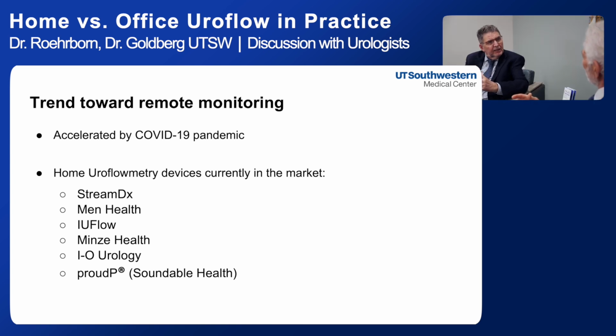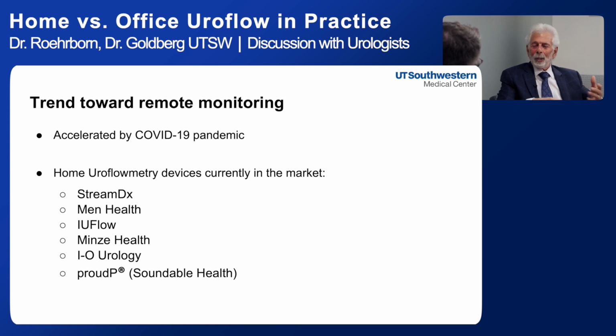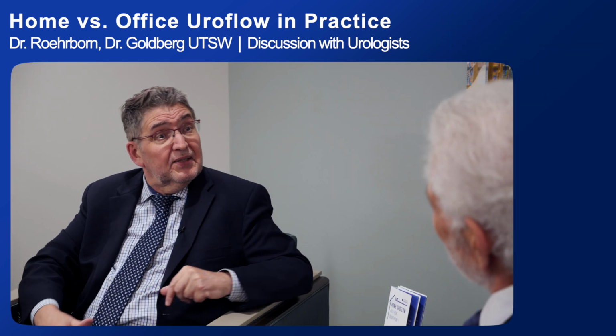So that's taking what we know as a spinning disc kind of container, and a cheap version of it, if you will, giving it to the patient to use at home. Correct, and let them deal with all the apparatus and the urine and the storage and the cleaning of it. And so I came across that there actually are apps out there that can be used to monitor home flow rates based on sound. No, that's the innovation, right?